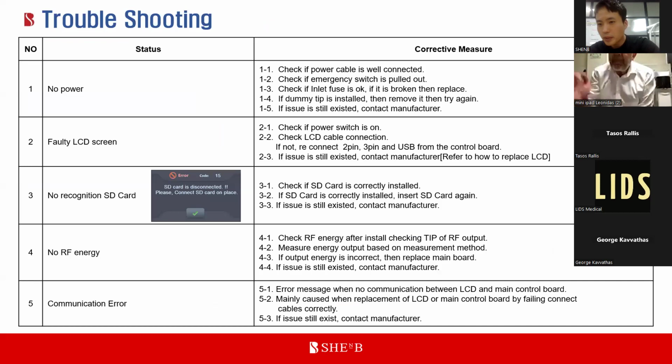So these are the typical errors that we face using Virtue RF. Of course, if there's no power and the machine is not coming on, we need to check the cable and the electricity, which is not a big problem. When we turn on the machine, there is an LED light on the front edge, and those lights will be changing.